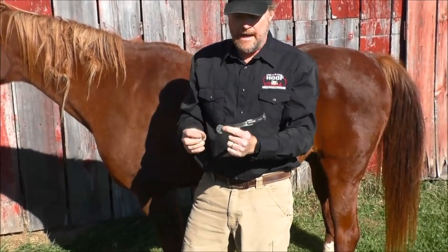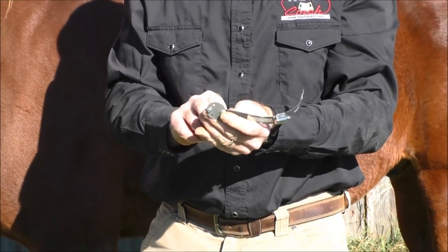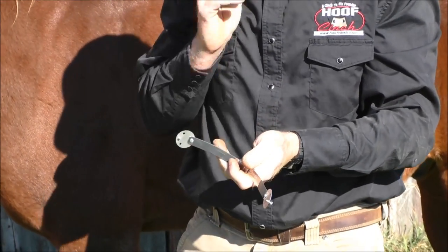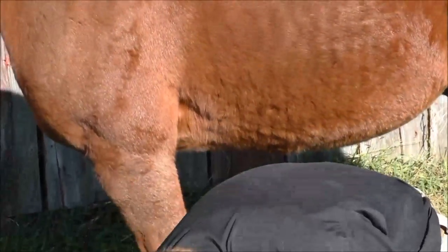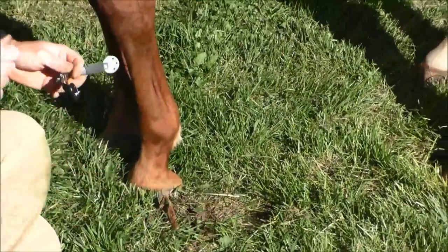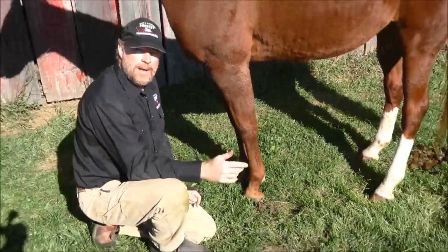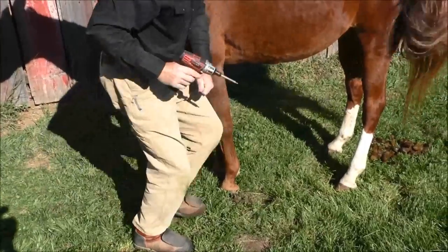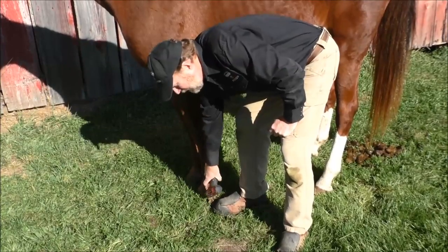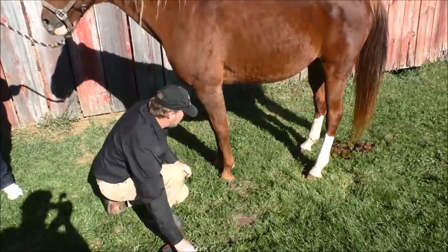Put one screw in each attaching plate. Normally I'll go in the center hole on the attaching plate and just go ahead and put a screw in. For this horse I know he's not scared of the drill, but if your horse may be nervous or you don't know, go ahead and stand in a safe position and run the drill by his foot to make sure he's not going to jump. Once you feel secure, then you can start with the install.